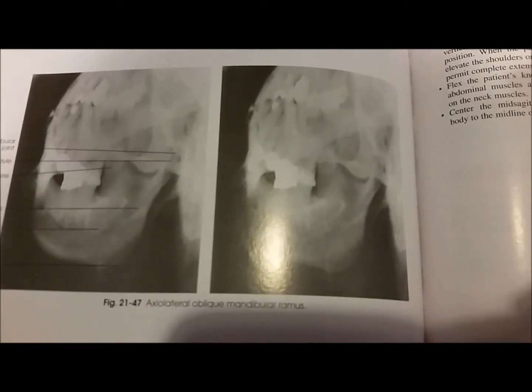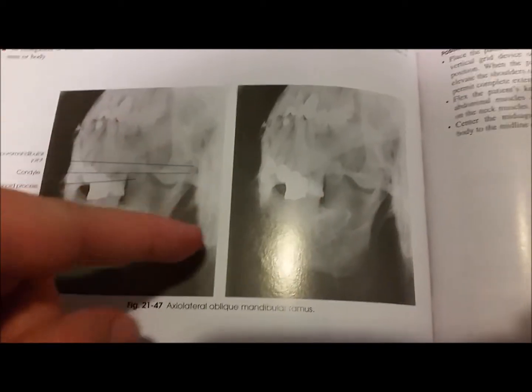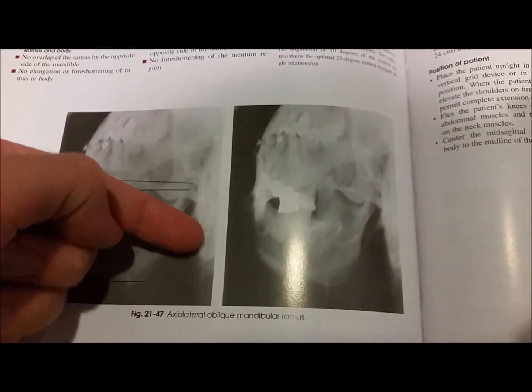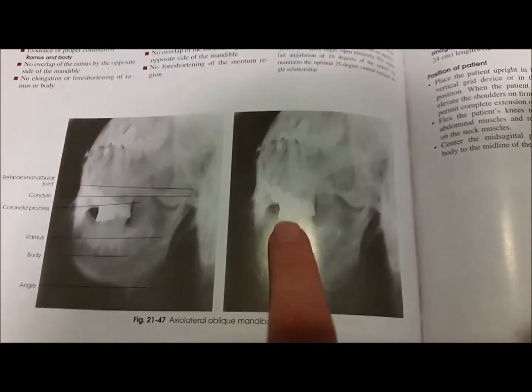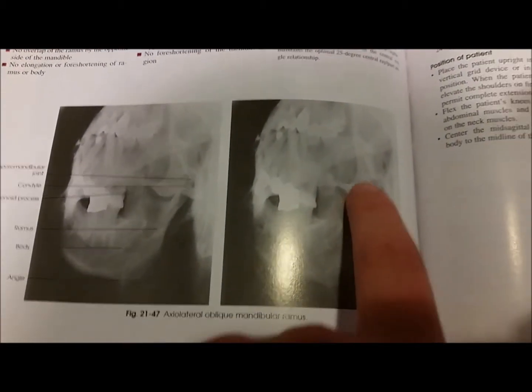Next we have the axial lateral projection, in this case for the rami. The side closer to the IR is going to be thrown downwards from the tube angle. The other side up right there shouldn't be overlapping with the bottom. You should be able to see the rami right there up to the TMJ.